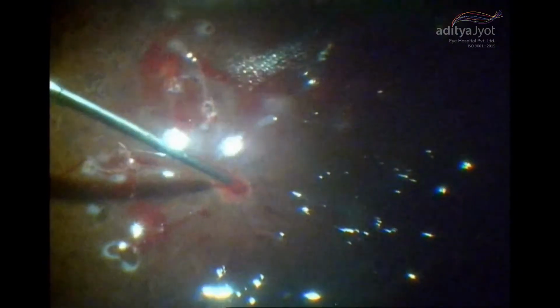And you can see the view, and the retina is totally flat. And then again at the final part, make sure there's no fluid. And now we are doing the laser around the pre-existing break, and the diathermy mark shows where the breaks were, and now again doing laser around it. Already there are old laser marks around it.